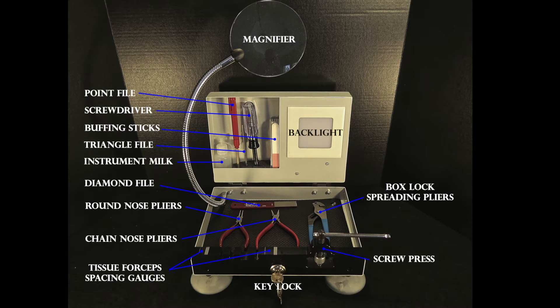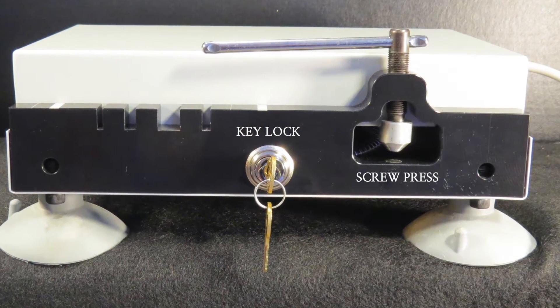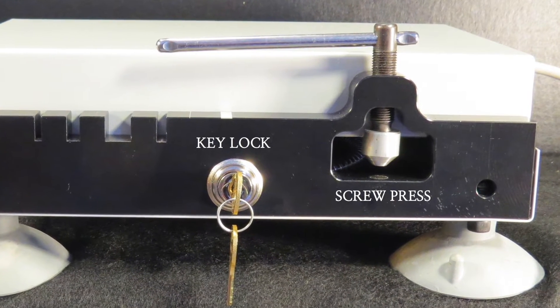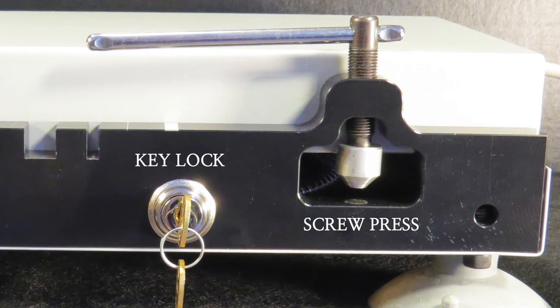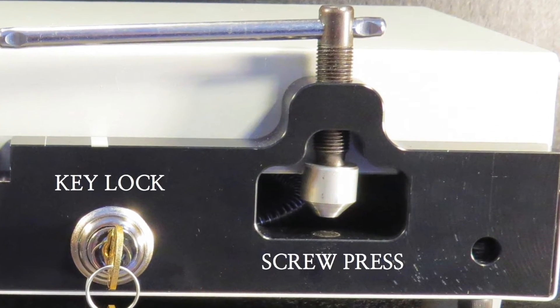The specific tool usage will be demonstrated in detail in the preceding training programs. Key Lock and Screw Press: The lock is provided to secure the tools in the bending station. The screw press is used to tighten the box lock of the ring handle forceps, and it can be used as a clamp to hold instruments for adjustment or examination.